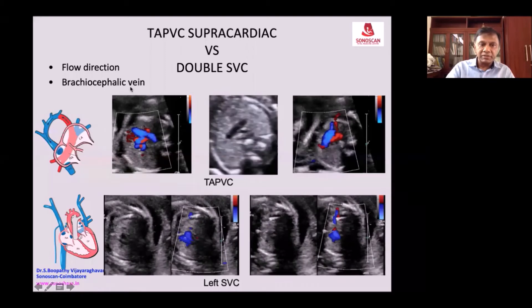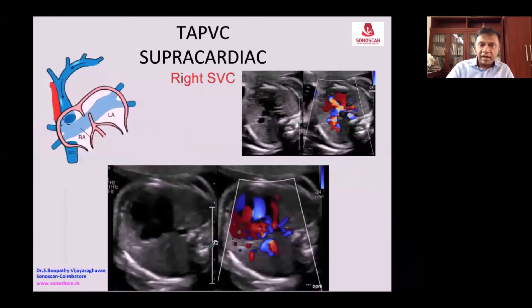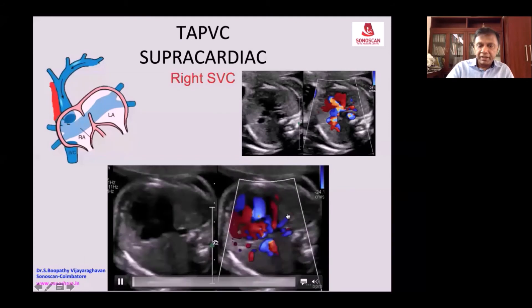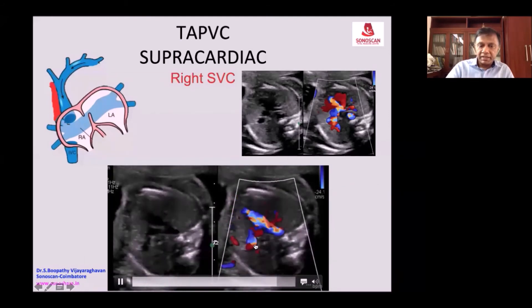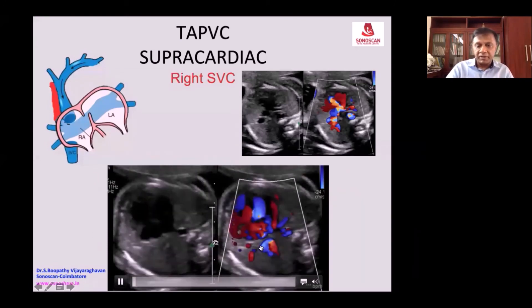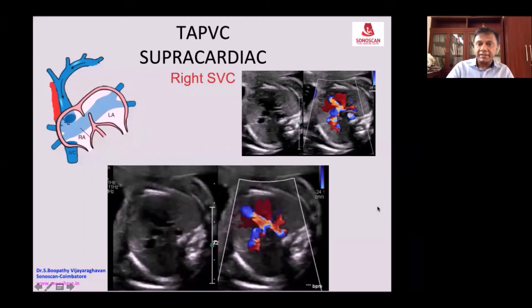You will see a dilated brachiocephalic vein in TAPVC joining the right atrium. The confluent vein is on the left side — red — then the brachiocephalic vein blue from left to right, and the SVC. You can see in the video the confluent veins — the vein going into the right SVC — and it ascends up by the side of the SVC and joins somewhere closer to the neck. As a result, there are two veins on the right side.